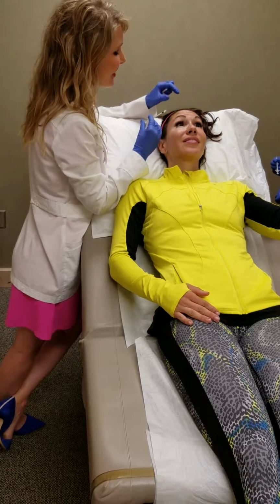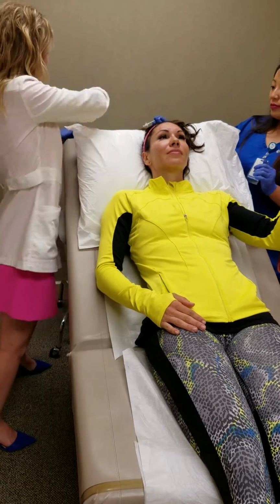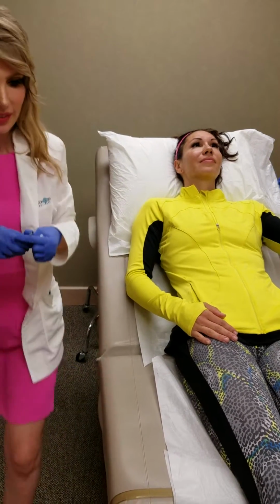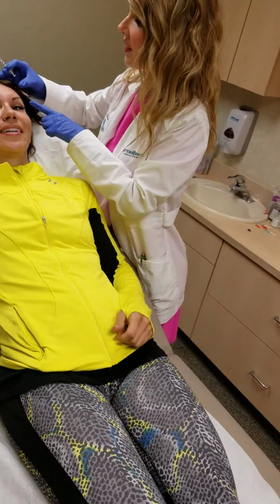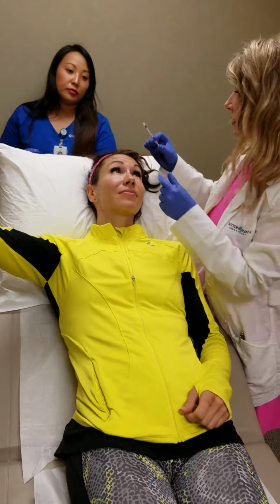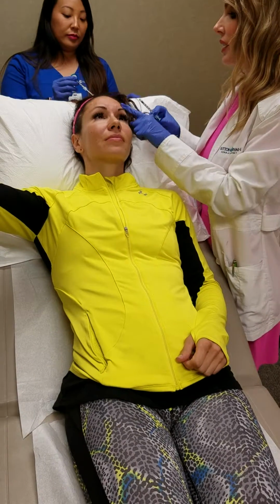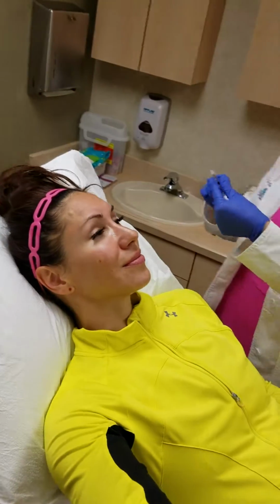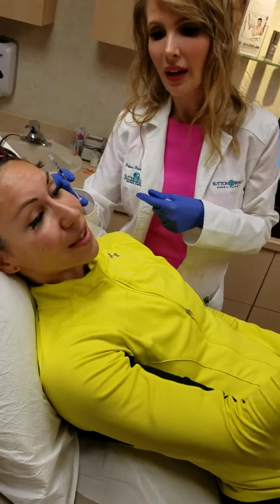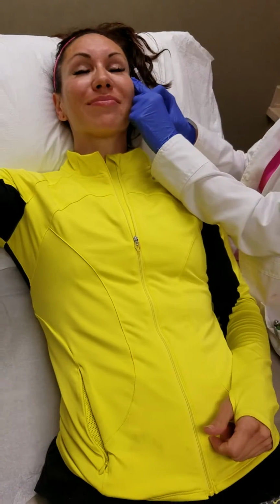Go ahead and raise your brows, yep, and relax. Little pinch. Okay. Almost there. Let me move around here. Okay. Good. That arm was getting tired. And then raise up again for me. Okay, relax. These are for those tiny little commas to make sure that Maggie has a really nice, smooth, uniform brow. All right, crow's feet. We bless these a bit because Maggie smiles a lot. So right now, they're coming out. This is going to go away. It's going to go away completely. All right, here we go.